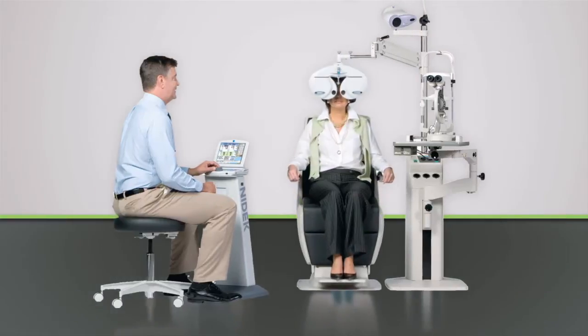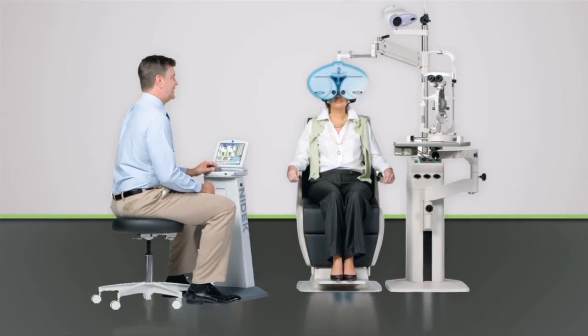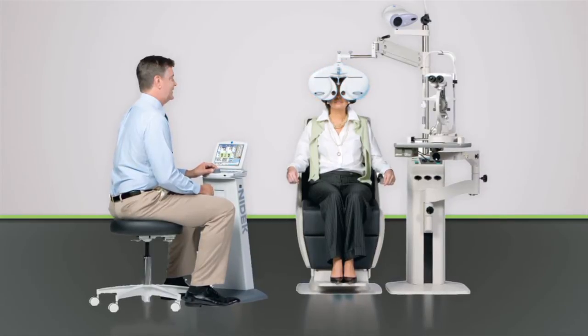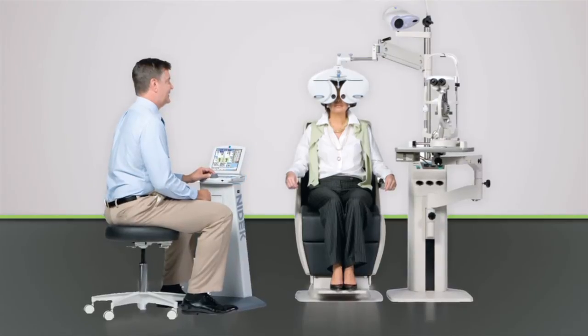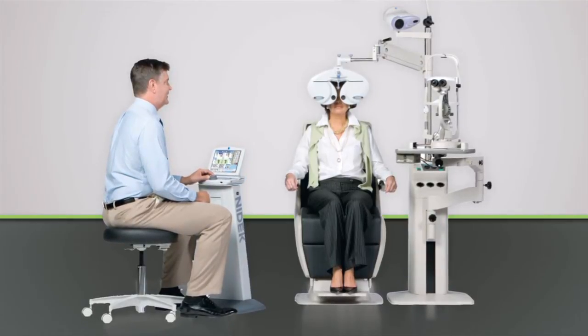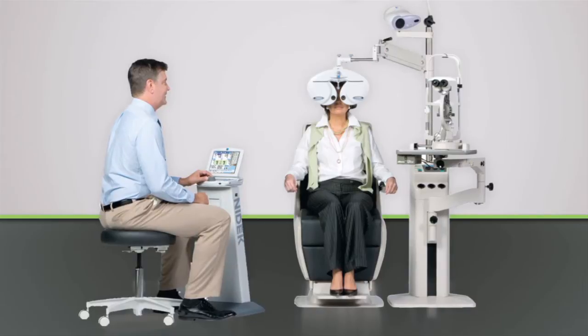Replacing the standard refractor, it allows practitioners to control the entire refraction process from a portable keypad small enough to sit in your lap. The operator can remain comfortably seated throughout the exam, eliminating repetitive stress injuries.